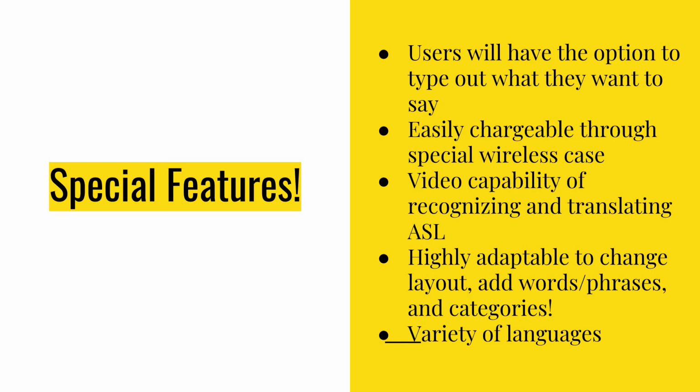Okay, so for special features, these are the things that I really had a lot of fun with, because special features are awesome and they're way cooler than my other features. So these are the things that I'm really excited about. Users will have the option to type out what they want to say, which I guess isn't that special because that's what Dynavox and different devices do.